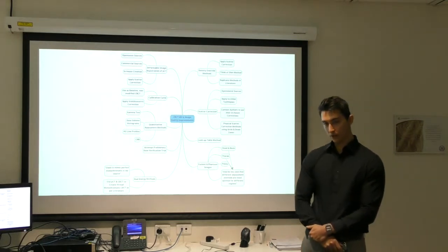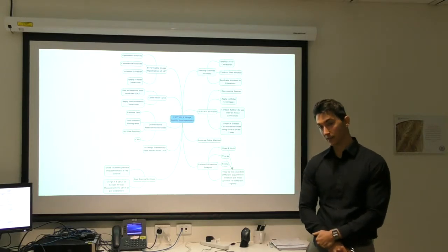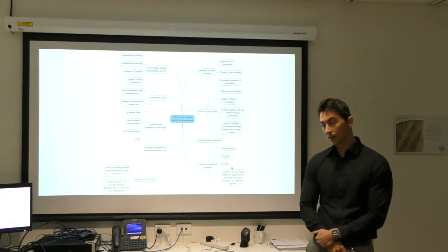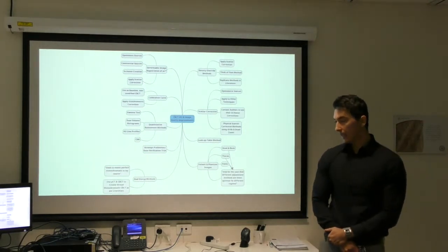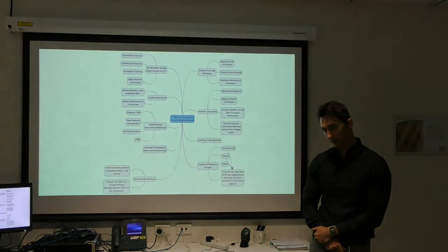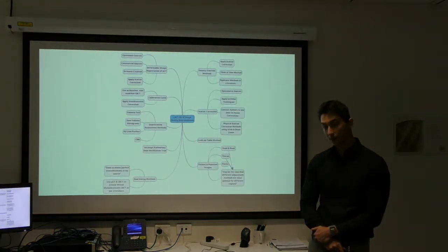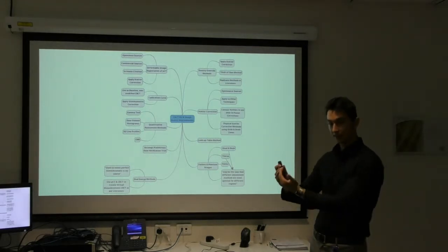this is where deformable image registration comes in. In an ideal scenario, there would be a planning CT taken on the same day as a CBCT to minimize anatomical differences. However, I foresee that might be a problem at this institution, so I think it's better to either deform the planning CT to match the CBCT. That may incur some errors, but that would, in theory, minimize the differences in anatomy, and then you would be purely comparing the image quality between the planning CT and the CBCT.